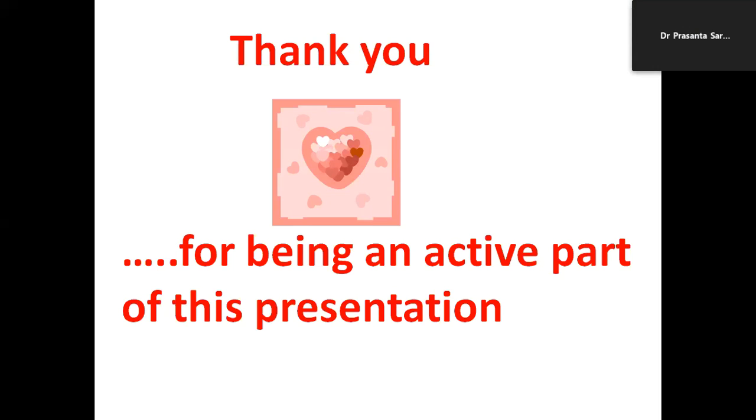Thank you, sir, for your nice presentation. I want to ask you the difference between monophasic and biphasic. Very simple. It is the direction of current flowing from one pad to another. If it flows from one pad to another directly and does not come back again, it is monophasic. In one direction current flows, and in biphasic it goes from one pad to another pad, or one lead to another lead, and comes back, and it keeps going like a cycle of current.